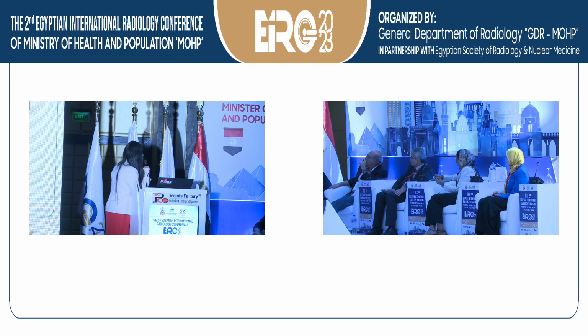Especially for donors. Donors, not recipients. For donors. Okay. Liver donors. Yes, evaluating their liver donors. No, donors, the liver donors. Donors, yes, definitely, doctor. And we could quantitate, say by percent, the degree of steatosis. Say 20%, 15%, 30%. Exactly, sir. We could do that using ultrasound. Yes, definitely.